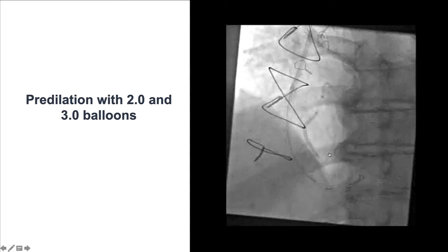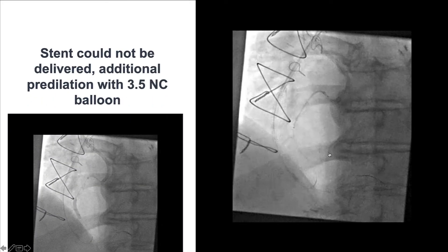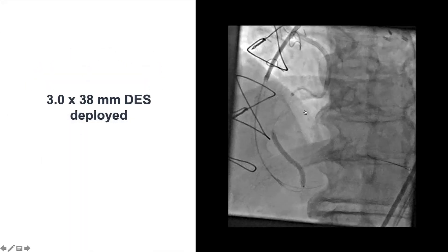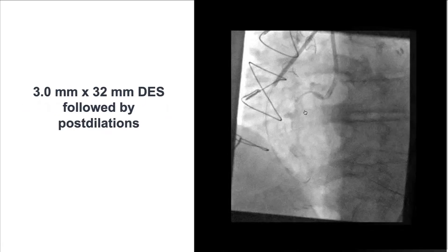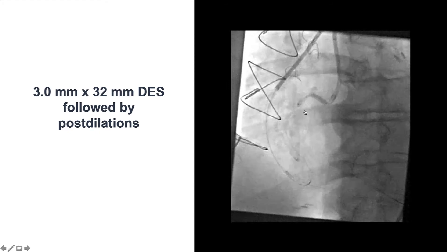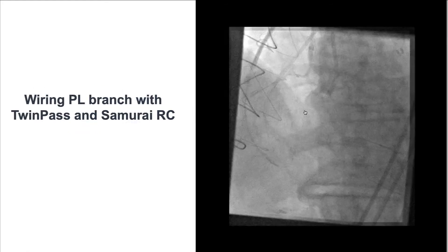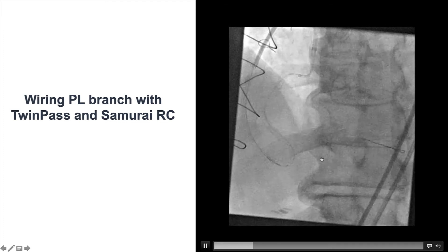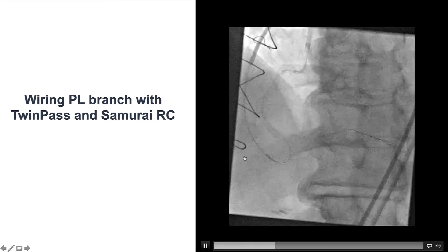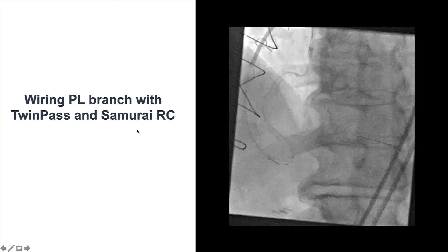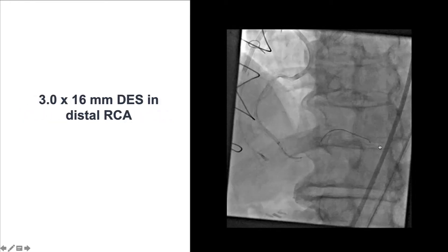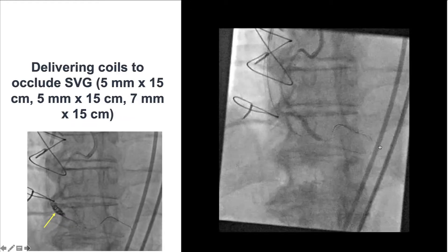We performed extensive balloon predilatation and had significant difficulty delivering stents. Additional predilatation and guide extension were used. Eventually we were able to deploy a drug-eluting stent, overlapped with another more proximally, and another in the proximal right coronary artery, followed by multiple balloon post-dilations. We had a bifurcation on the distal cap, so we used a Twin Pass and a Samurai RC to advance a guide wire to the posterior lateral branch, then placed an additional drug-eluting stent in the distal right coronary artery.